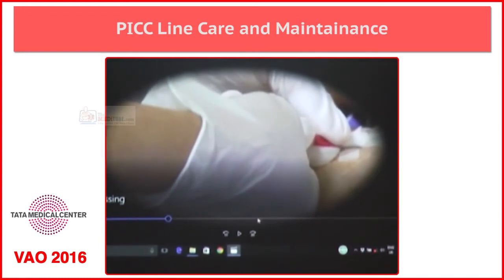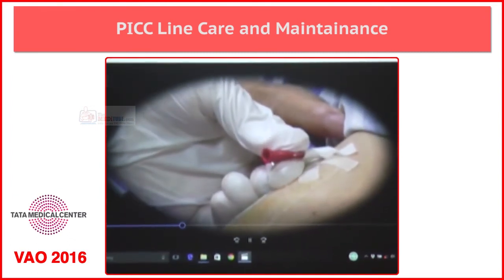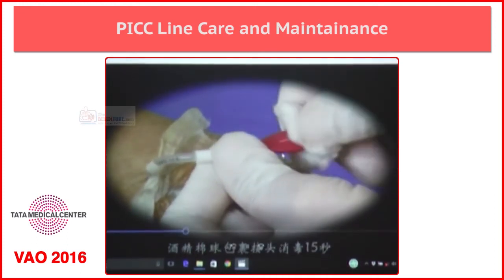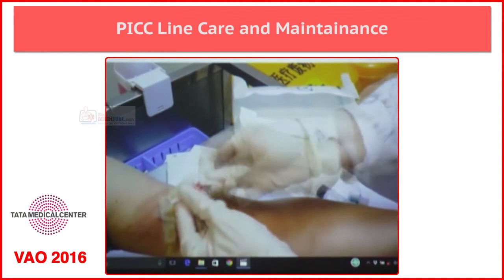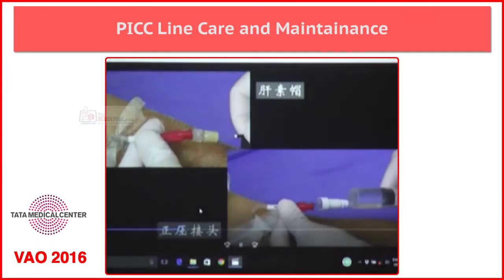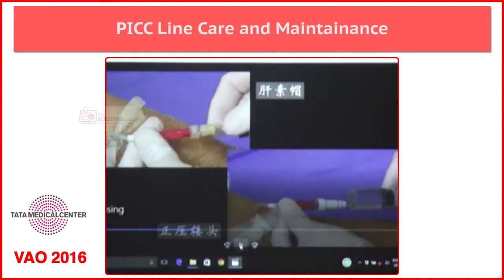Without opening the dressing, the first thing is to clean the hub. You can observe that the dressing is still on. If you open the dressing and start cleaning the hub, there is a chance of catheter pull-out. So first you should clean the hub before opening the dressing — clean it properly at least 15 to 20 times. Now you can connect the new connector which is prepared aseptically, and then flushing is done.